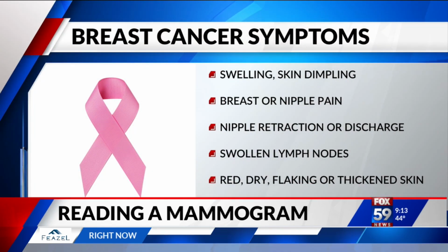Well, other symptoms for breast cancer can not only be lumps, but they can be changes in the skin. They can be pulling in of your nipple. Pain is very rarely a sign of breast cancer. More common signs are dimpling in the skin and the nipple changes and the lumps. And the lumps on the mammograms appear as white densities. And unfortunately, if you have dense breasts, the dense breast tissue also appears as white densities. So it can be very hard to detect the lumps initially on the mammograms with dense breasts. So that's why so many women end up coming back for additional imaging, so we can further evaluate those areas and try and find those early cancers.